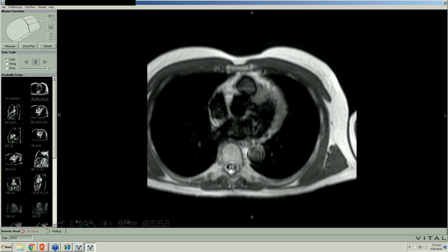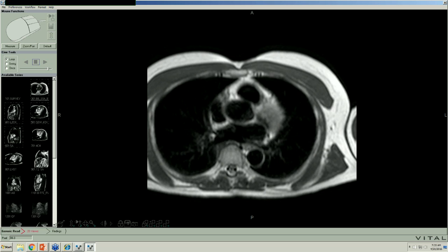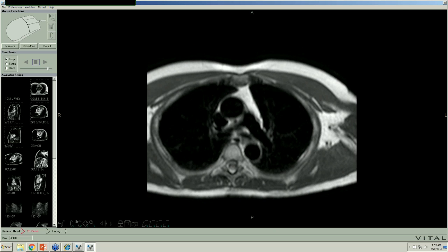We did do an MRI at some point, and we said, you know, maybe we need more objective information. We're always concerned when there's main left calcification. We're always concerned that there's something we're missing. And so let's take a look at the MRI here. And again, the whole idea of this conference is to get you on board with advanced cardiac imaging as we add MRI and CT to our repertoire.